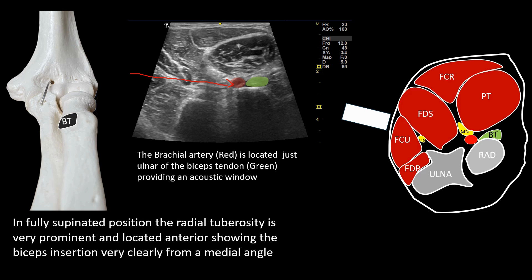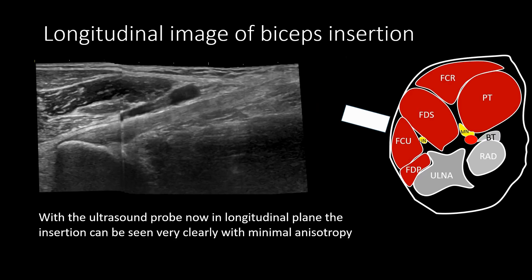This approach leads to the kind of image you can see here, where there is very little — if any — anisotropy, and the tendon fibers are very clearly visible where they insert. This is a landscape image, but nevertheless you can see very nicely the tendon insertion.